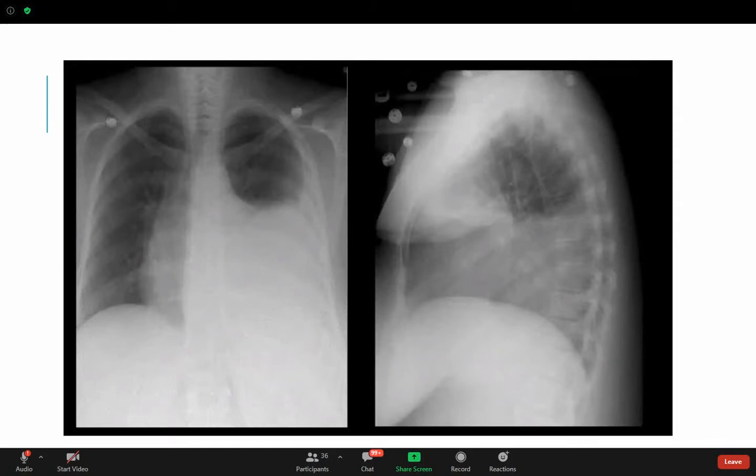How can we confirm this is actually pleural effusion, guys? In an X-ray, or let's say using an X-ray technique. Base of the lung. That's a good try.